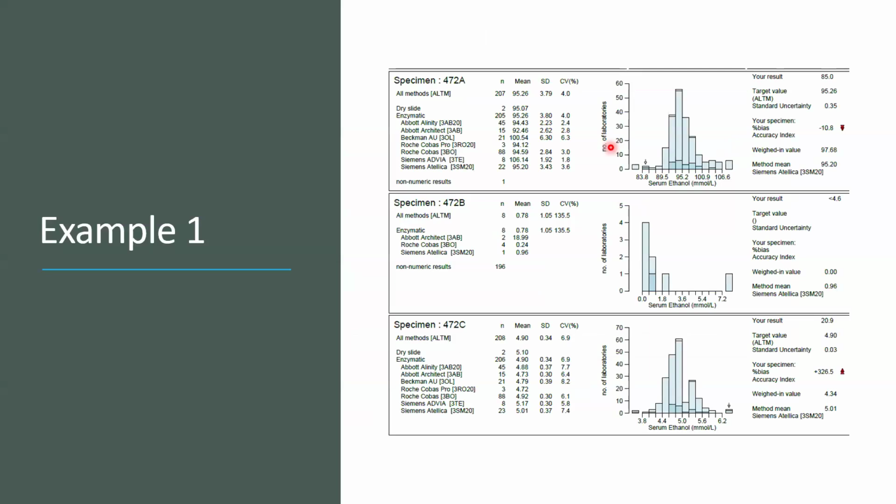So I'll now show a few examples from our lab where the EQA has gone wrong. These examples are chosen to illustrate the transcription or post-analytical, analytical, and pre-analytical issues with the EQA samples that have led to an abnormal EQA result.